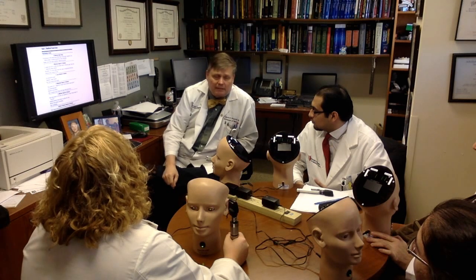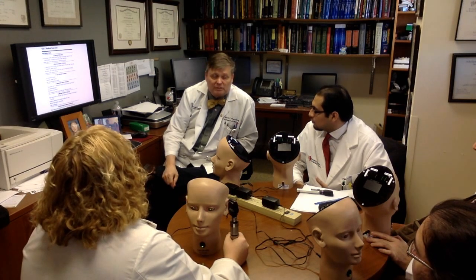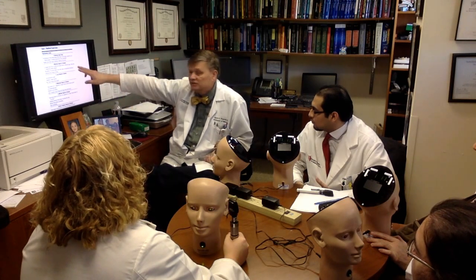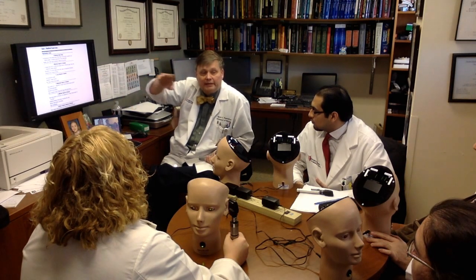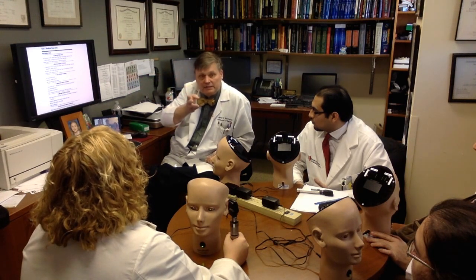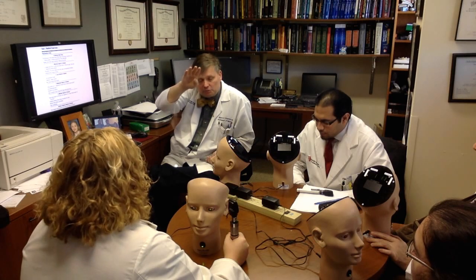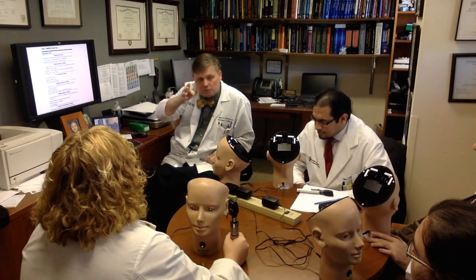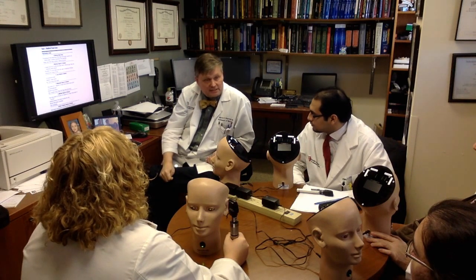The ophthalmologist will grade papilledema on a scale of 0 to 5. 0 means normal. 1 means there is early papilledema with just swelling of the margin of the disc, superior, inferior, nasal, but not temporal. This is the inverted C. We'll see that in a second.